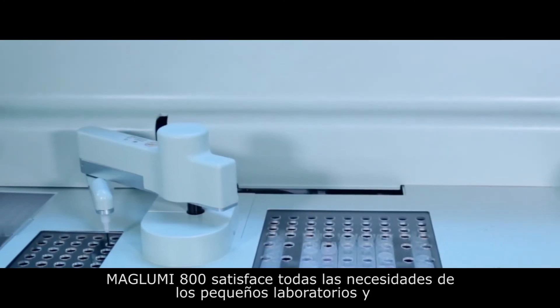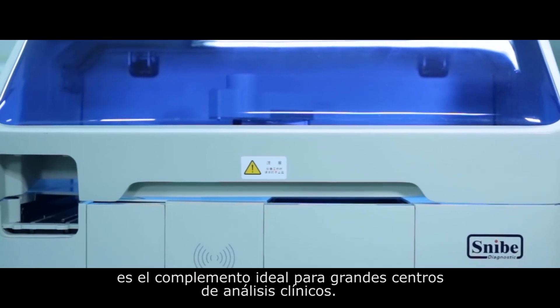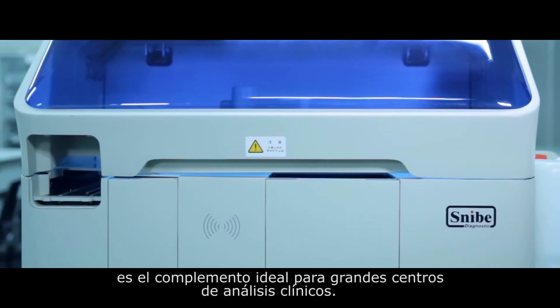The Maglumi 800 has ideal sample and reagent capacity to fully meet the daily needs of small laboratories and as a complementary tool for large hospitals.